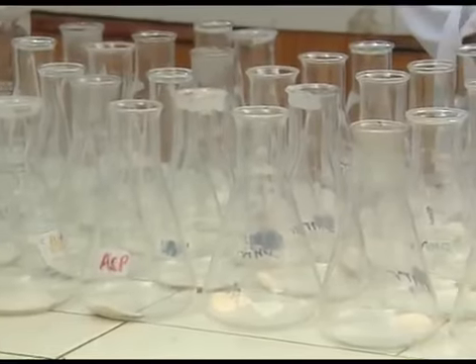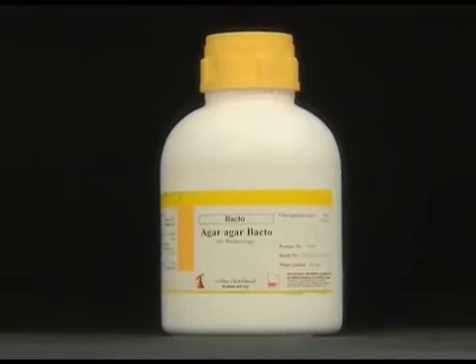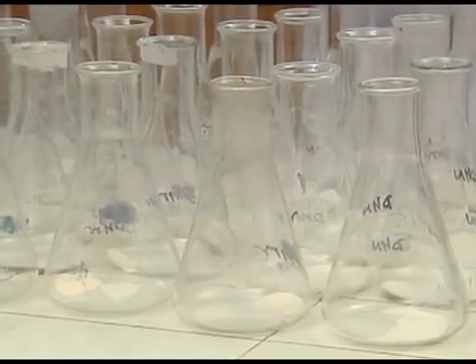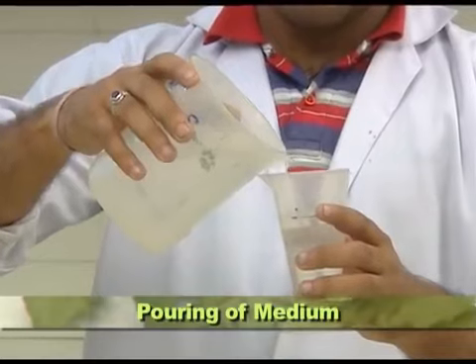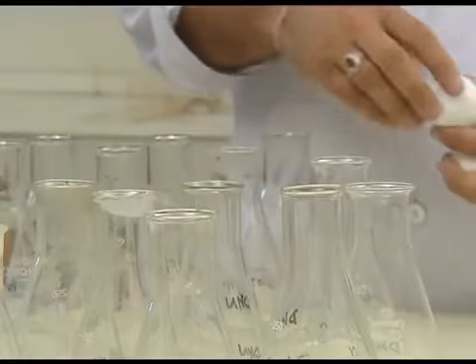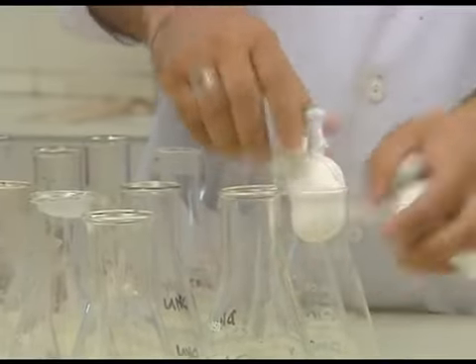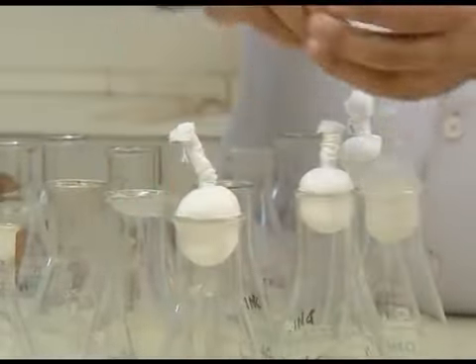Semi-solid medium has to be prepared. The method followed is to weigh 0.75 to 0.8 grams of agar-agar. This amount has to be optimized to provide optimum moisture to the cultures. Pouring of medium. 100 milliliter medium is carefully poured into each 250 milliliter Erlenmeyer flask and plugged using cotton plugs made of non-absorbent cotton wool covered with muslin cloth and tied at the top, allowing easy holding of the plug while inoculation.